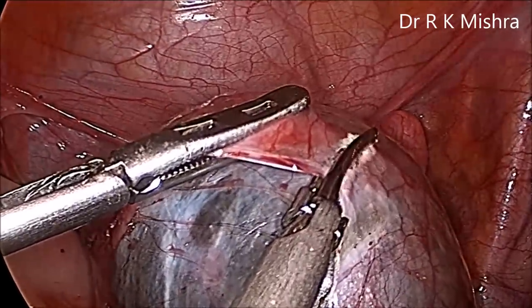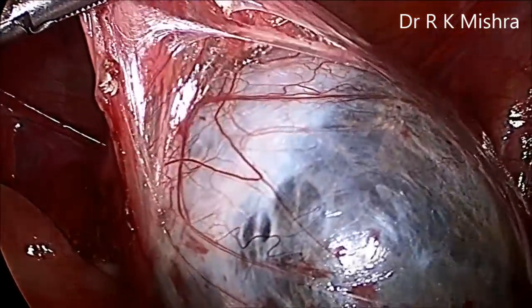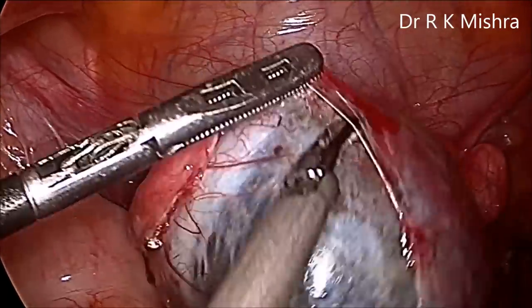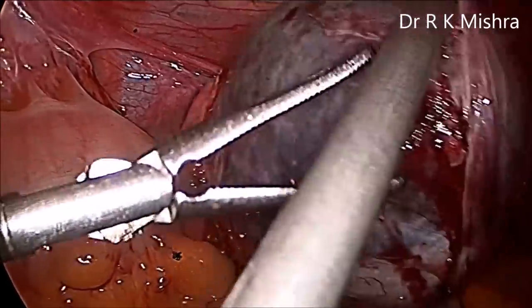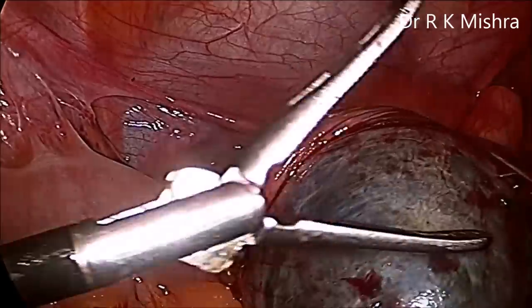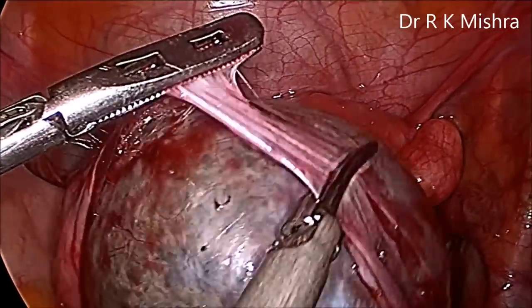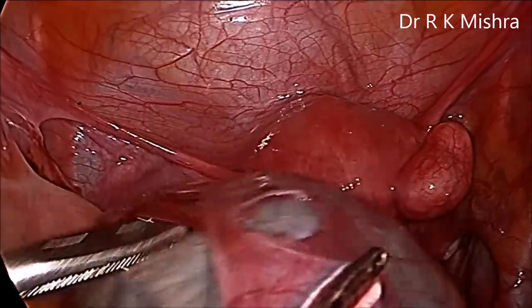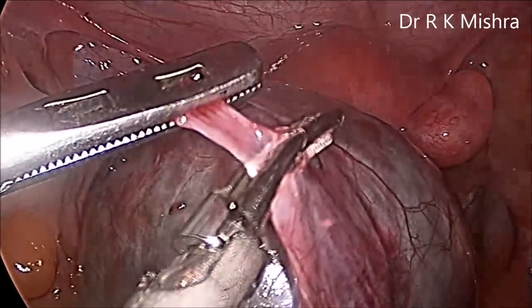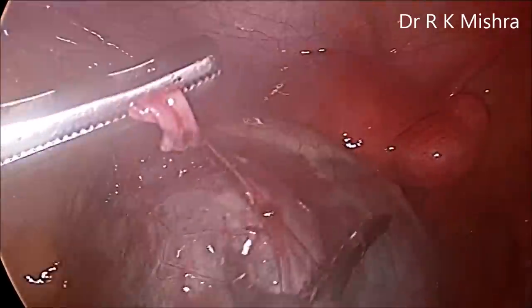The harmonic is slowly dissecting the cyst, taking care that collateral damage should not reach the fimbrial end of the tube. This is the fimbrial end. Our main concern is that the cyst cavity should not rupture — it should be gentle, as excessive stretch can tear the tube and major mesosalpinx, and bleeding can start. To control the bleeding, if you use monopolar or bipolar, remote injury and collateral damage can shrink the tube and create problems.